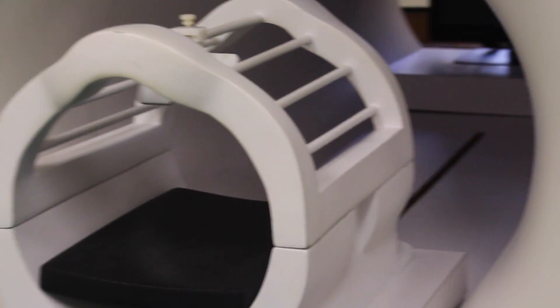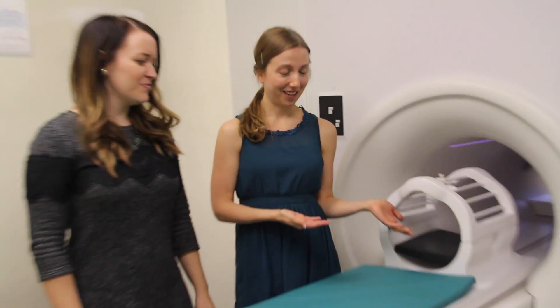Then we moved on to another technique we use to study the brain. We're going to be checking out this MRI machine — it's not a real MRI, otherwise I couldn't have the camera in here, but it is a pretend MRI that we use sometimes to get kids used to having an MRI before they go over and get a real one. It is made out of wood, basically like a prop for a play.